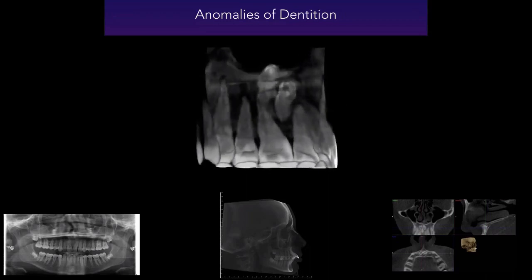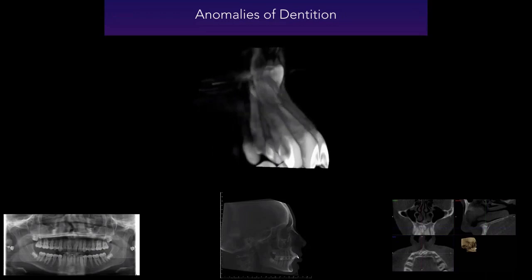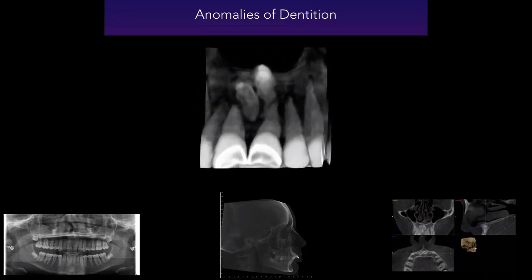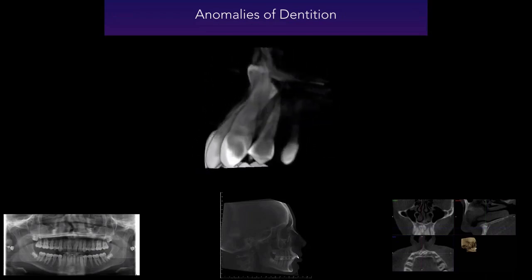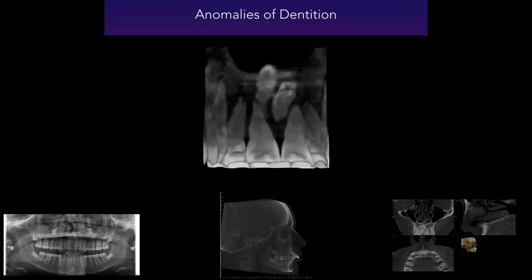And then you've either, A, potentially caused damage to those teeth, or B, you finally get frustrated enough and say, I've got to get more imaging. And then you either send for a CBCT or some periapical radiographs, and you realize, oh, that's why I can't upright the teeth. The problem with CBCT is that many times you don't know you need it until you've already got it.